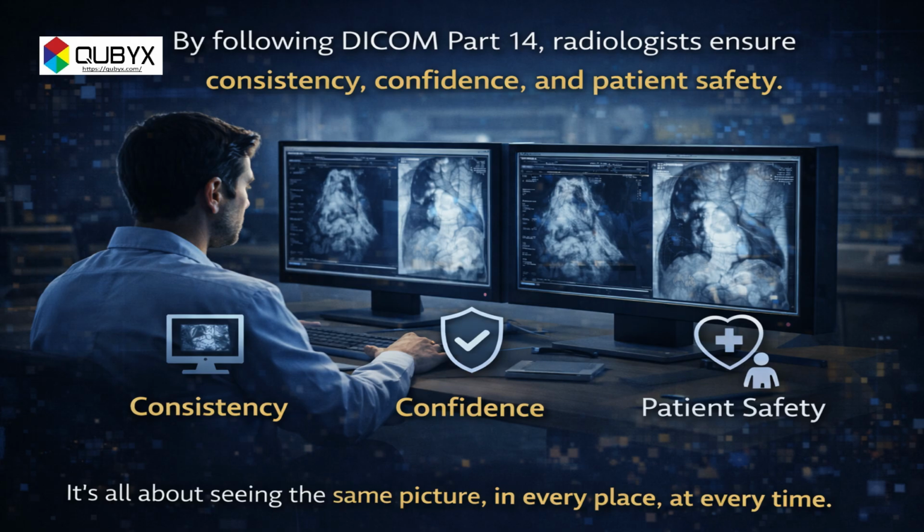Best practice in remote radiology includes regular GSDF calibration and verification, centralized monitoring of display compliance, ambient light assessment, and documented quality assurance processes. Display accuracy must be treated as a clinical requirement, not a technical afterthought.